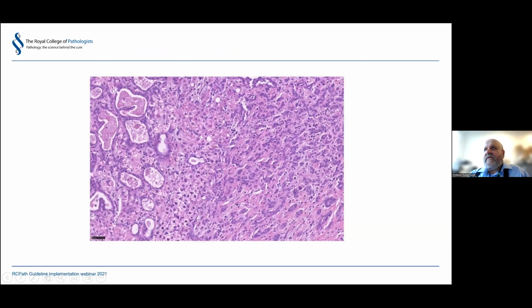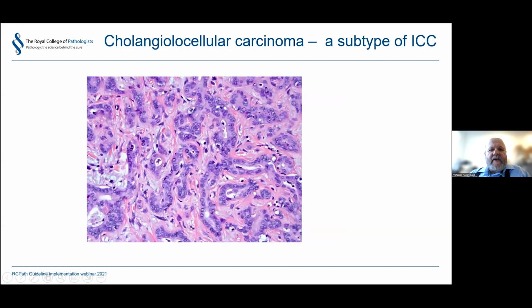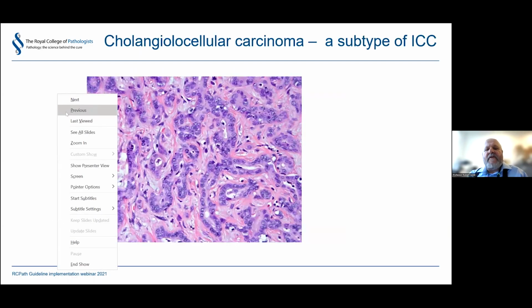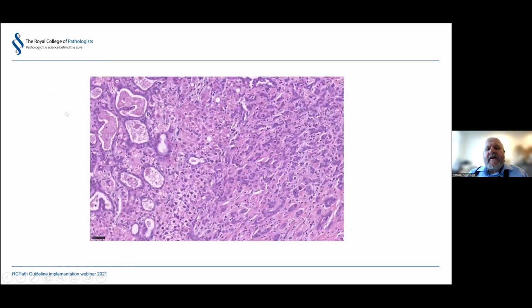This is something that we've known has existed for a very long time. There's been a focus of increased interest in recent years. I guess the most important take-home message is that this diagnosis is made on H&E. It's got to look like an HCC, it's got to look like a cholangiocarcinoma, and then you can make the diagnosis. Immuno is supportive at best, because we already said HCCs can be CK19 positive, so that doesn't make it a mixed tumor.